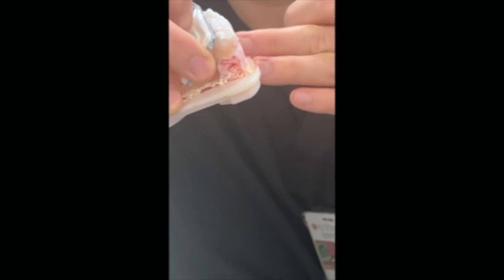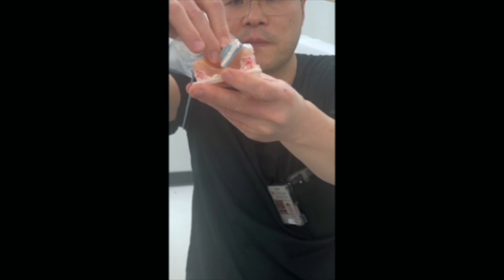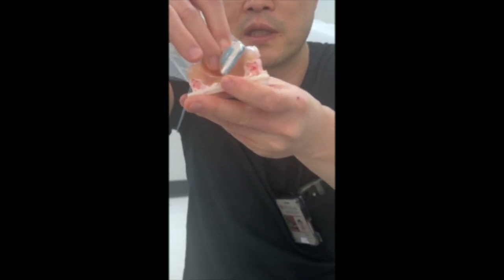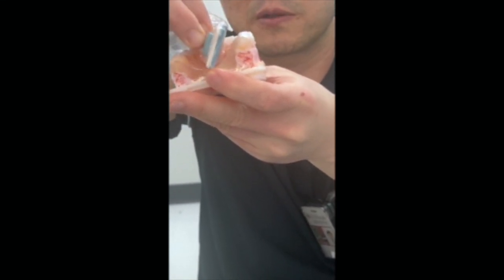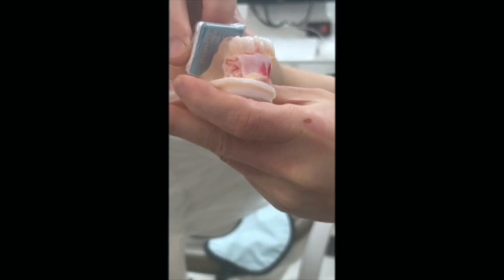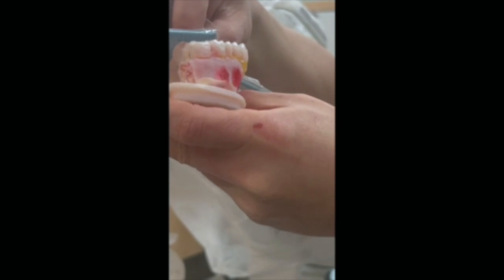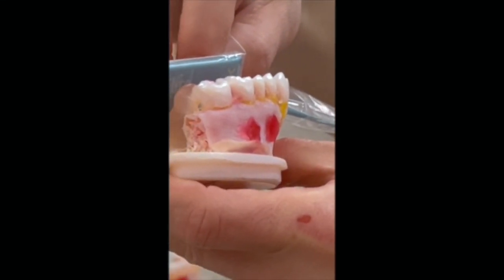it's important to verify the working length. To see the mesiobuccal, distobuccal root for your working length in a complete radiograph, for example, the master apical file radiograph, you'll want to take it as shown in the video. So it may be important to take 2 vertical angulations for the mesiobuccal and distobuccal root as well as the palatal root.